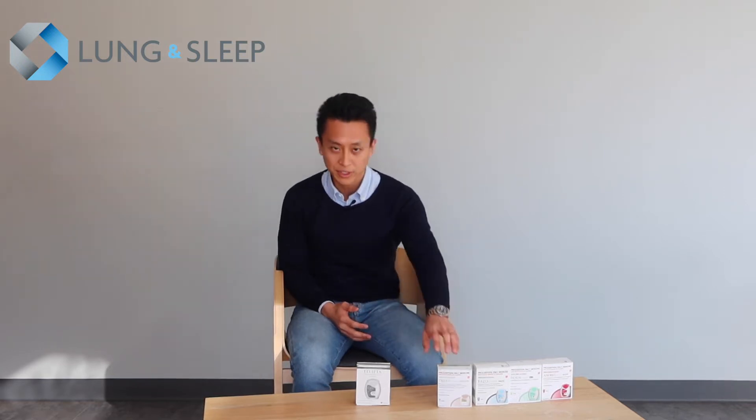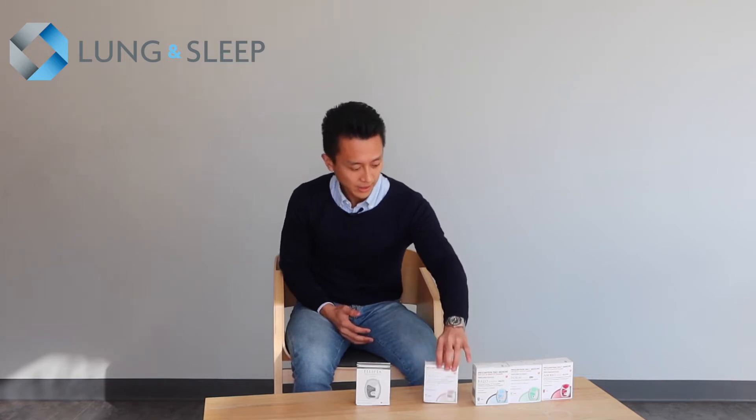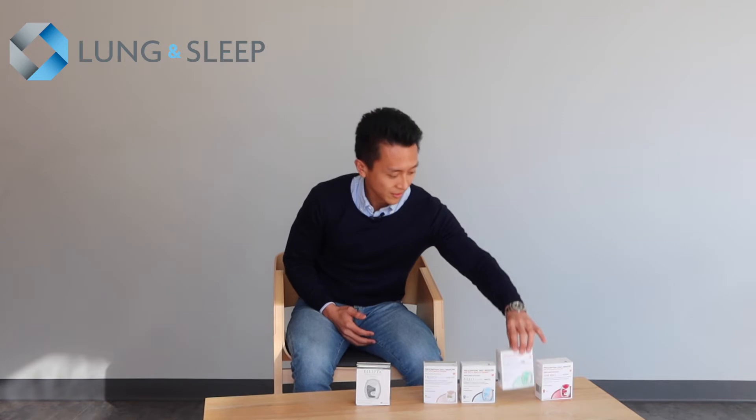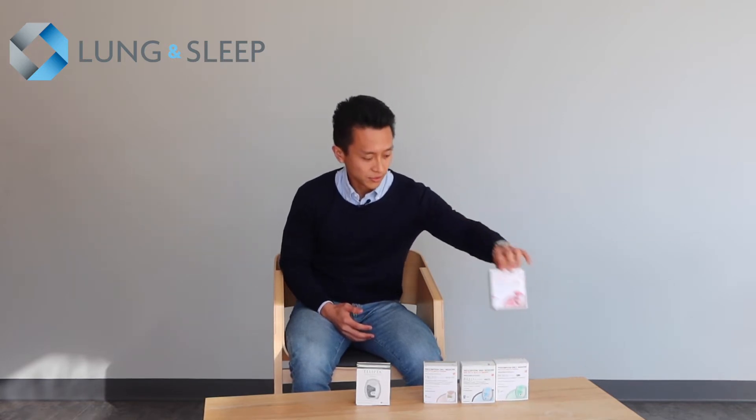If you've been prescribed an Ellipta device by your physician, most likely you've been prescribed Trelegy, Breo, Incruse, or Anoro. These four medications come in this Ellipta device.